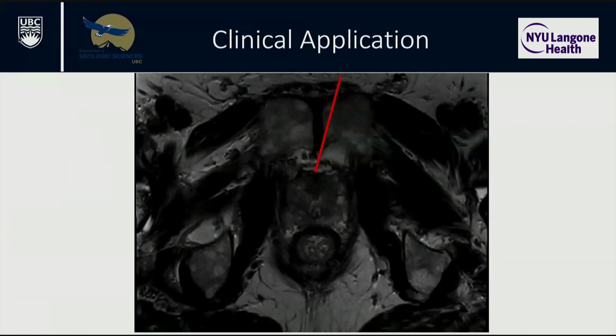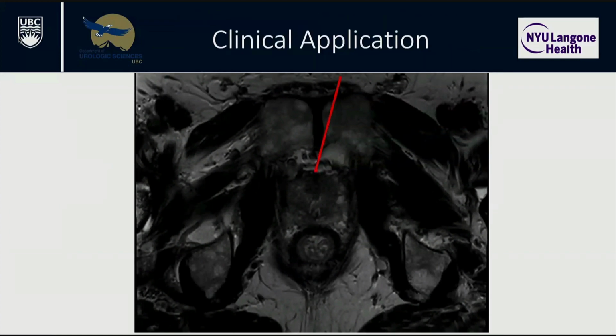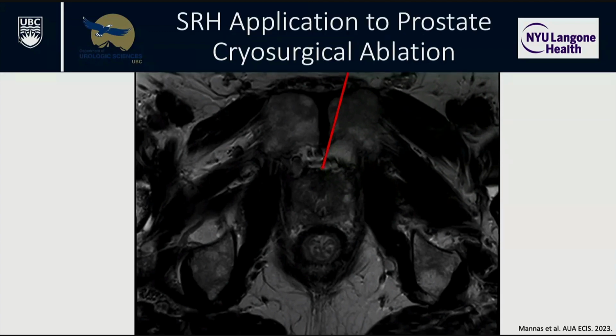So let's talk about clinical application. Clinical application can be for treatment or for diagnosis. The microscope that I was using was located in the hospital around the OR, and all the biopsies are done in clinic, so I couldn't do it during diagnostic biopsies the way they're normally done. But we could start applying it during focal therapy. This is an FDA approved device, so we can just consent patients that we're going to be doing margin assessments and then modifying treatment. So what we did is we took a biopsy from the MRI identified lesion. Now this is all done under ultrasound registration.